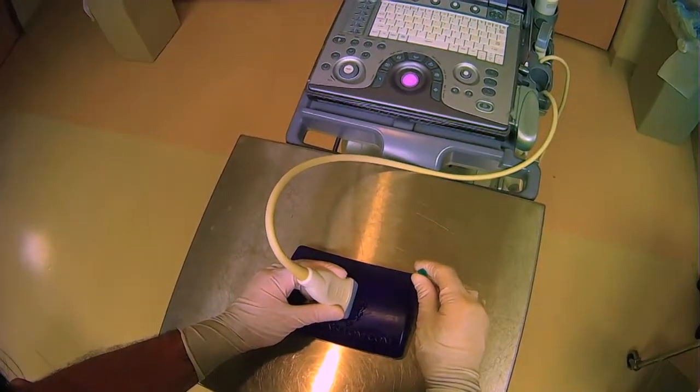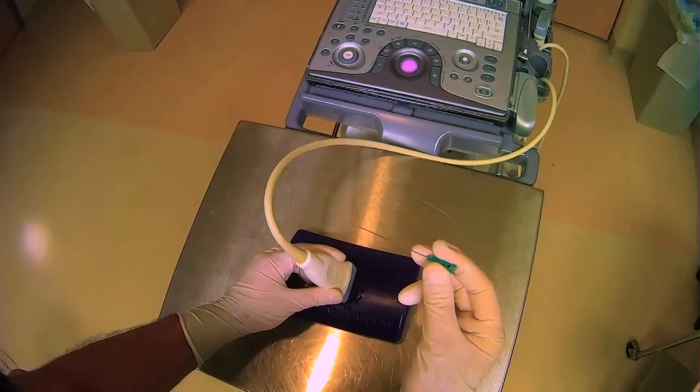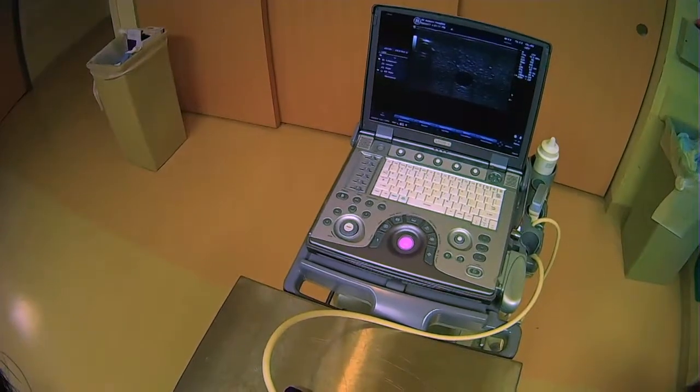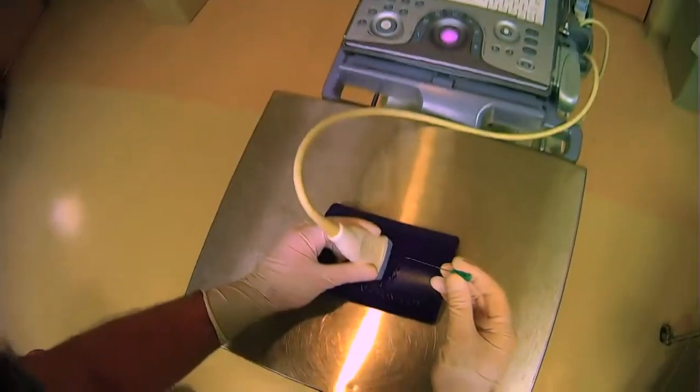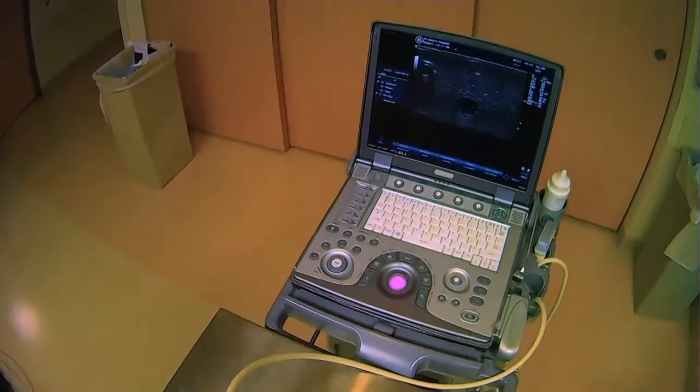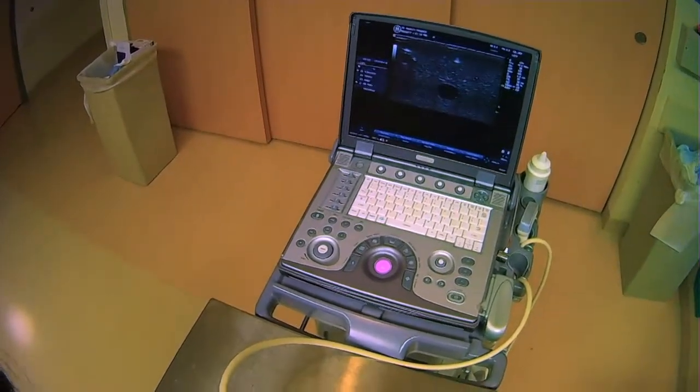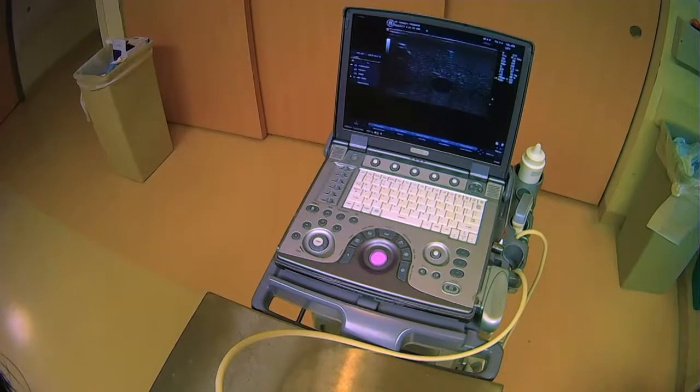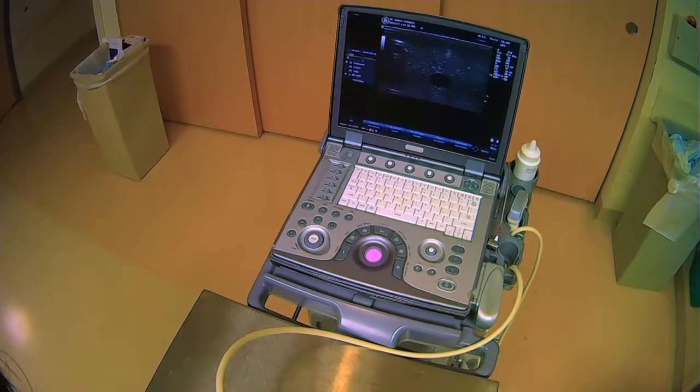So what I want you to appreciate here is the difference. We're going to still go in the center of the probe right here but we can see that already I've barely entered and I can see my needle tip right there.